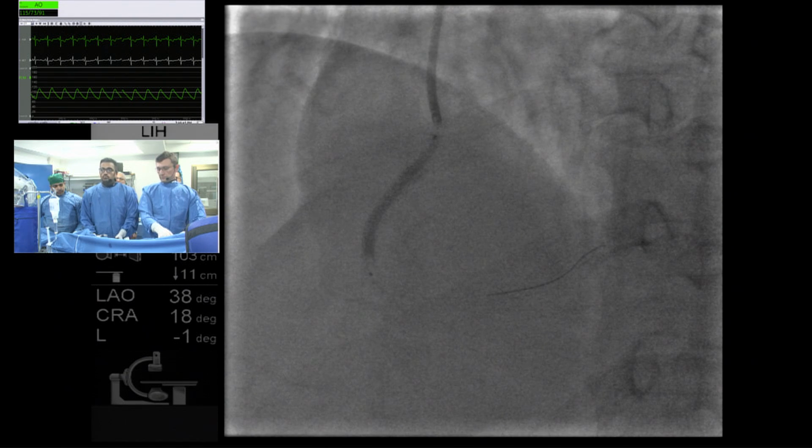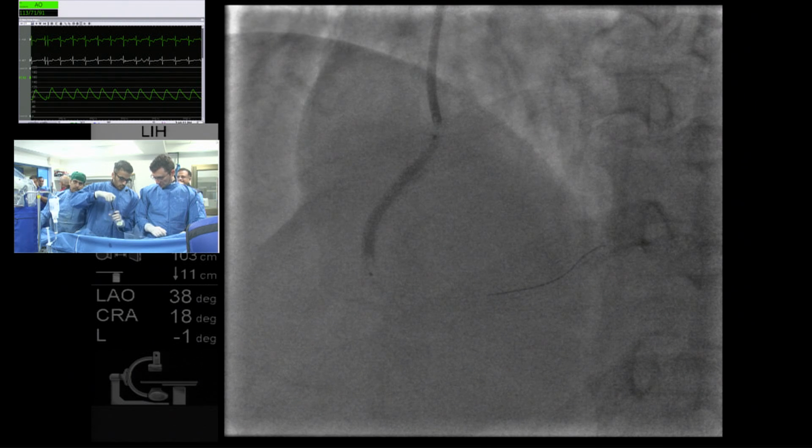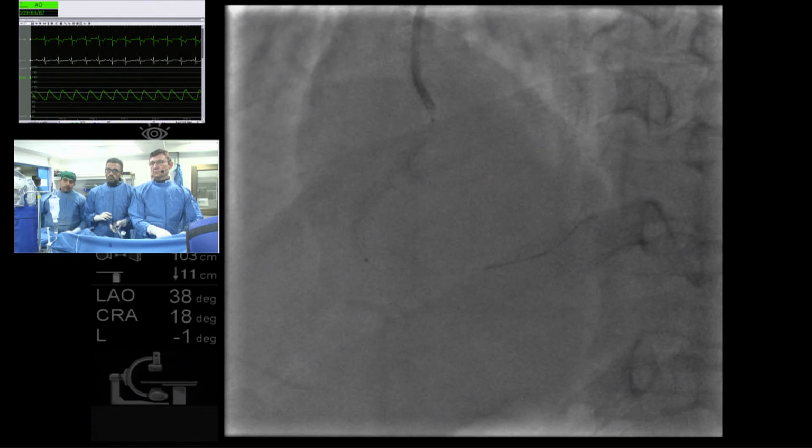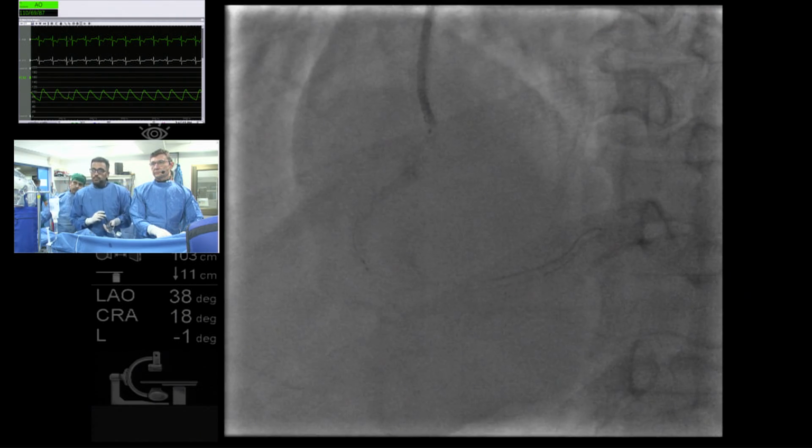And simultaneous ulnar compression is almost like a balloon pump for the radial artery. In the balloon angioplasty days, we used to put a balloon pump to keep the lesion open. And here we compress the ulnar to keep the radial open. We'll demonstrate that in the next case or so.